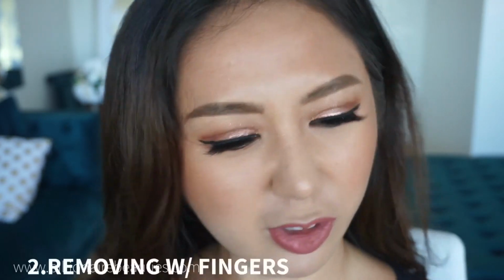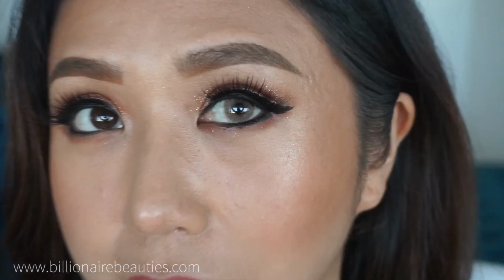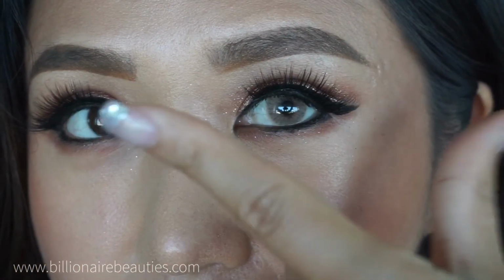I really don't like using my fingers that much because I've got long nails. Sometimes you don't know what's stuck in them, but I wash them. So with this one, I usually use this finger here, the marriage ring finger, and then I go like that. I push it down a little. Let me zoom in. And then I use these two fingers to grab them off.